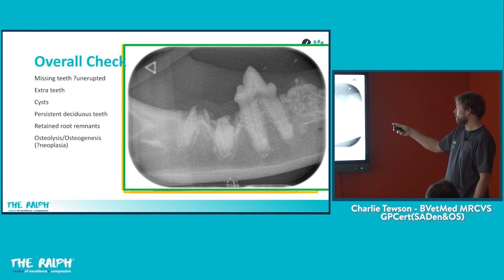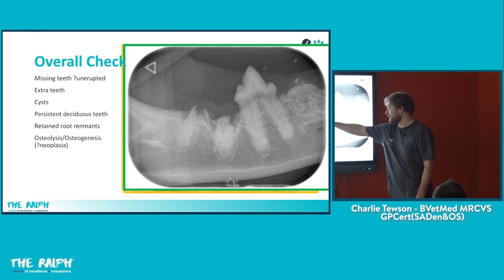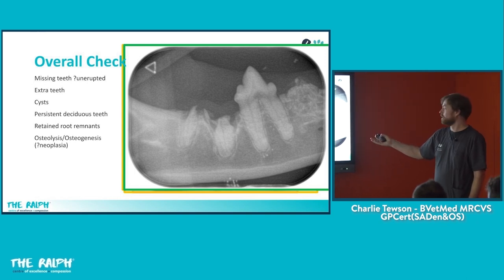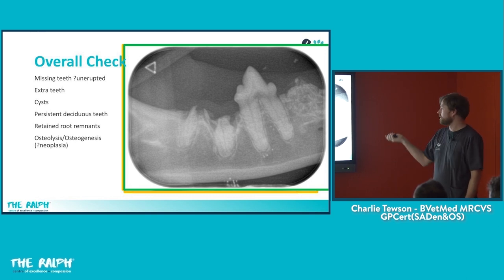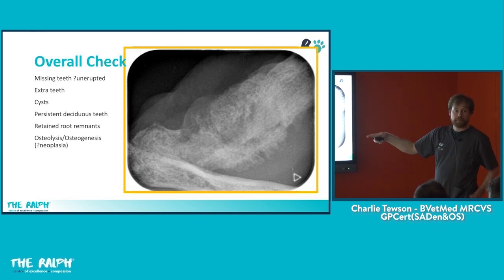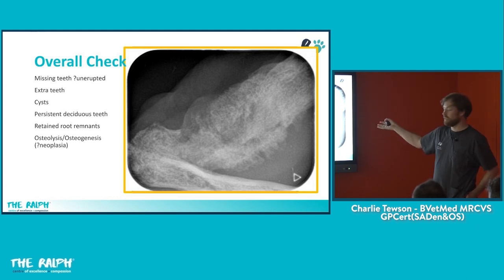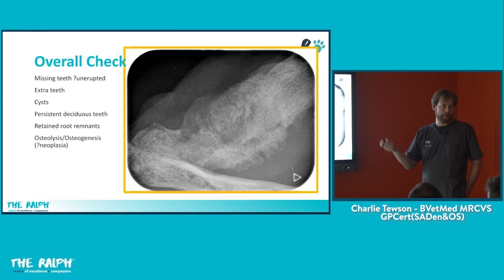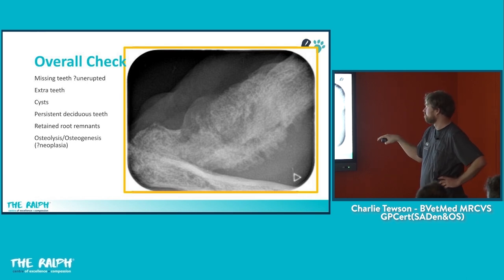Retained root remnants. This case was referred because of complications post-surgery — they'd done a crown amputation. With good quality dental x-rays it's pretty clear that this was not an appropriate candidate for a crown amputation. This cat had a lot of inflammation at the back of the mouth, was really painful, and immediately much better once those roots were taken out. An important part of the overall check is to take a step back and check for any really weird bone — this extreme example of a cat's left mandible is pretty typical for squamous cell carcinoma, though without a biopsy it could be osteomyelitis.